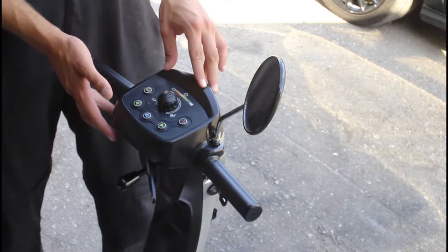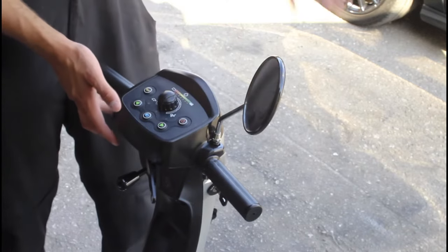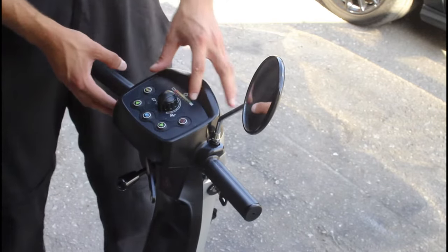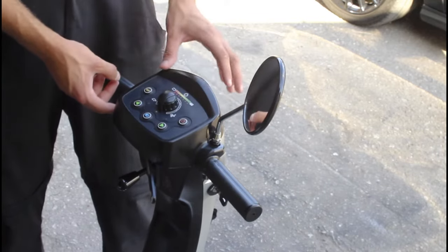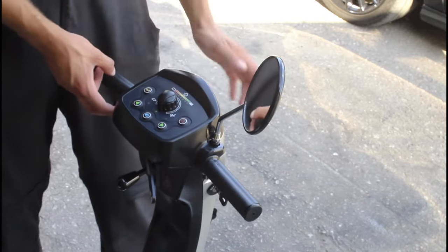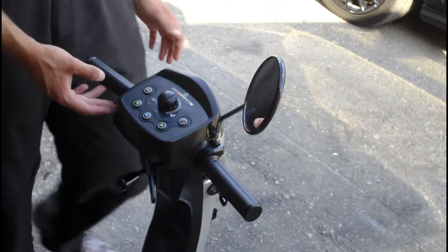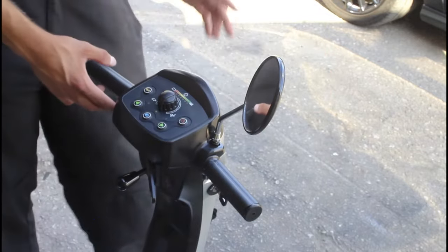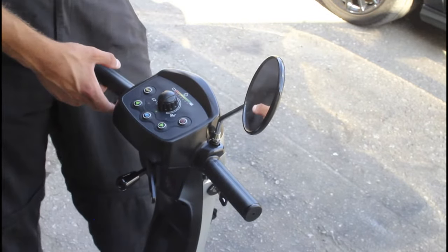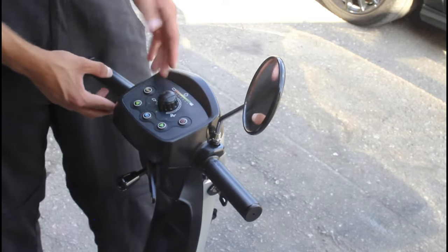I've got the back end raised here. If we turn it on at full speed — it's a four mile an hour — you can see the battery gauge isn't going down. I'll tap the horn and put the front lights on — these batteries aren't going down yet. The Leo is a four mile an hour scooter with 33 ampere hour batteries, so it has a range of around 10 to 12 miles.